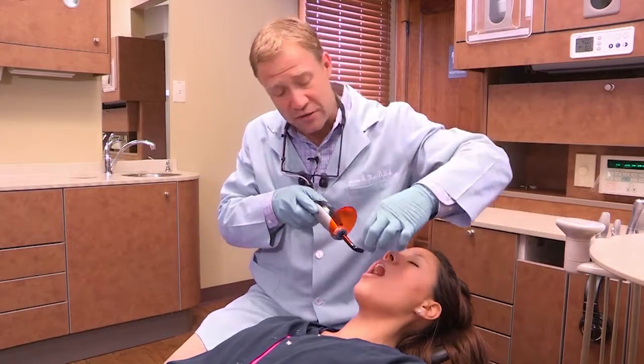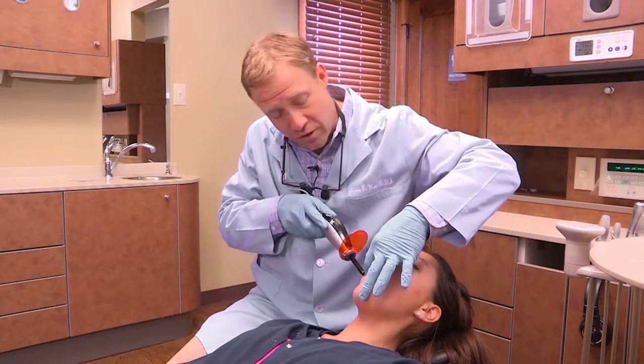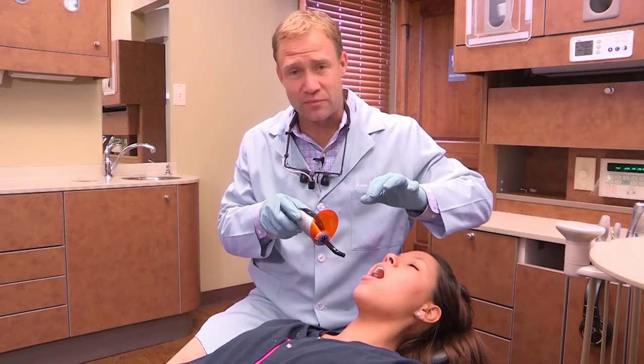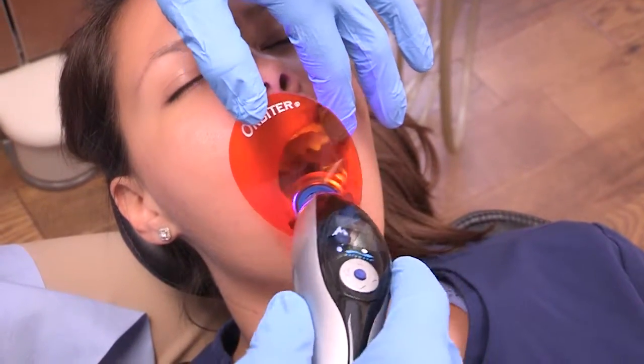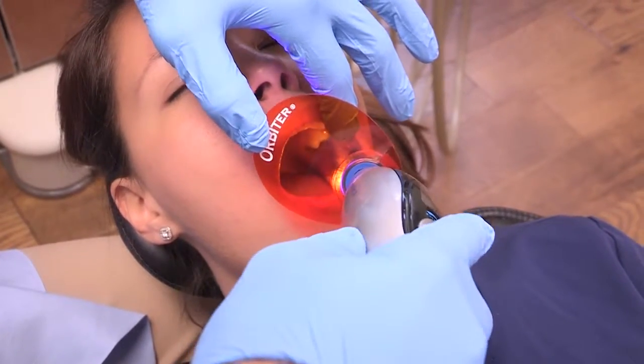There are some areas, frequently for interproximal restorations, I'll cure from the buccal and then the lingual. The filter may not quite be in the exact position I need it to be. So the technique I use is, as I'm coming into the patient's mouth, I'll place my thumb on the filter and just kind of rest it on.